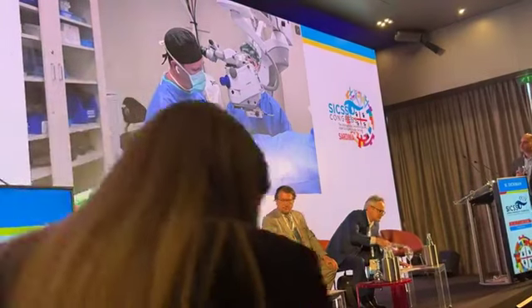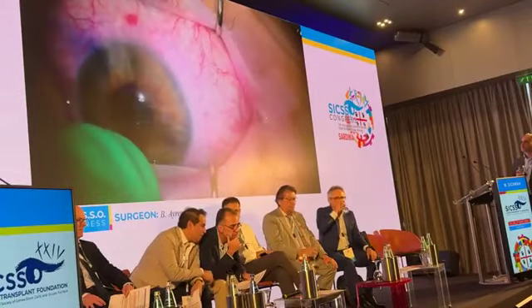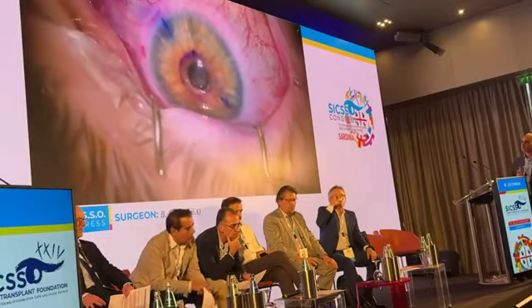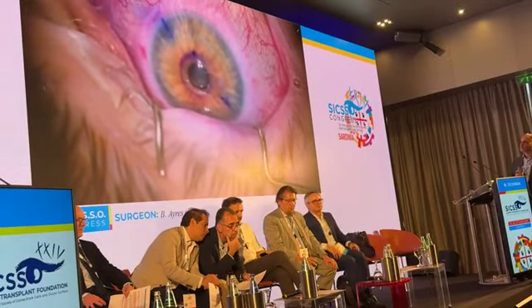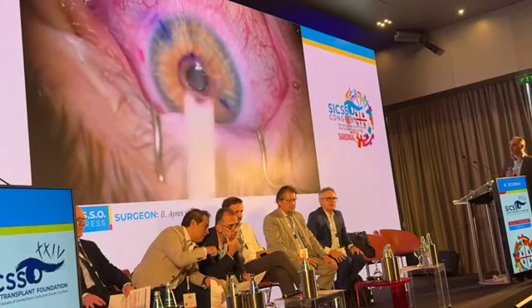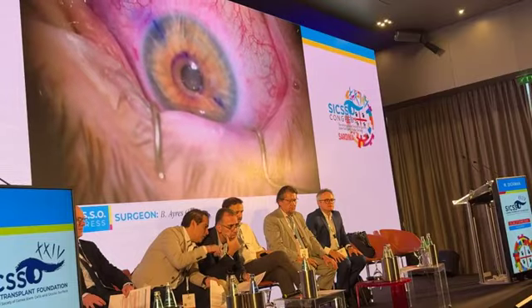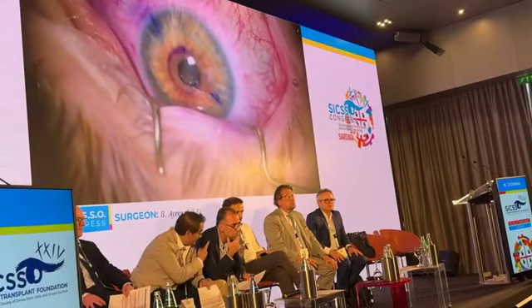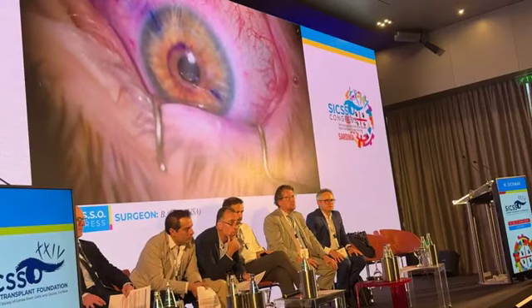All right, Hunter, I'm going to put the lid speculum in for you. Lots of bright light for a couple minutes, and you're just looking right at my light center. Good job. What we did is we measured the pupil center at the microscope, and it was 2 millimeters over from the pupil center. Oh, this is 2, that was the wrong one. So we had pupil center and over 2 millimeters, and then pupil center down 2.5 millimeters, sorry, for his plan.